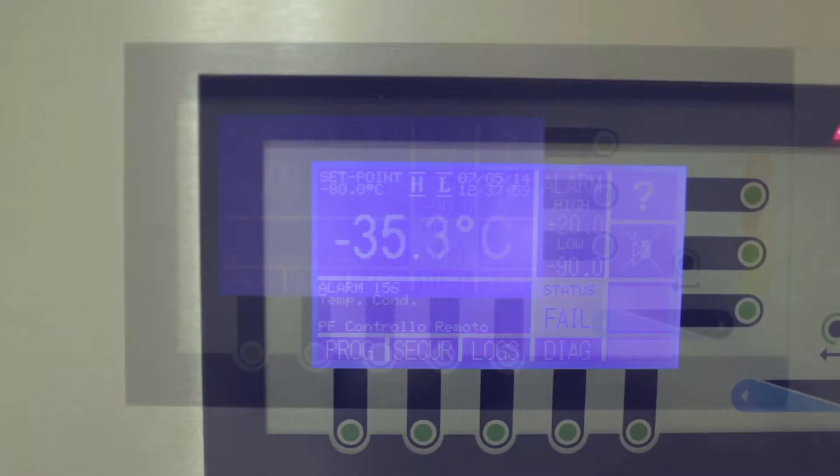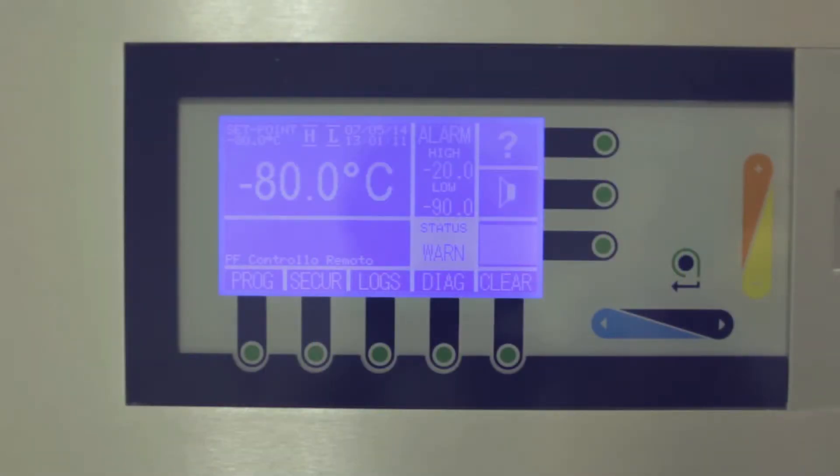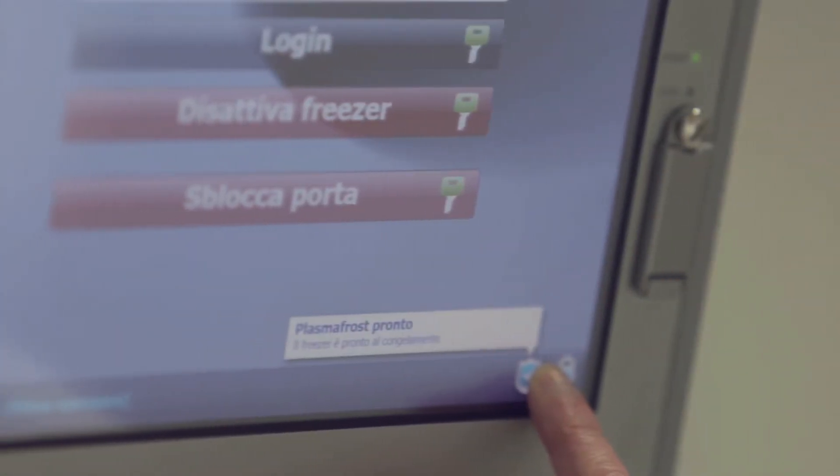Once ready for the first load, a confirmation message is shown on the touch screen. Once logged in, the operator proceeds to load the equipment.